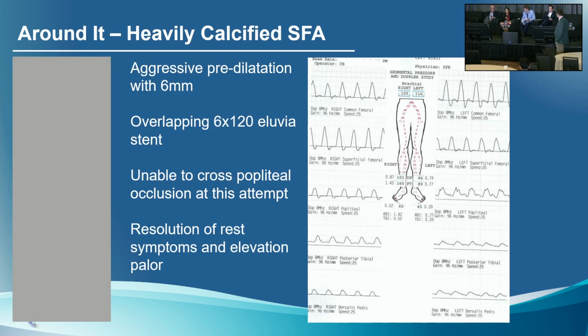Did you consider doing intravascular lithotripsy? We did. Because we're in the subintimal space, we had decent expansion, and so we felt that we were going to have an optimal result with stenting and didn't take out an intravascular lithotripsy device. So Shirling, you would do IVL in a subintimal space? I'm asking, there's nothing wrong. I'm not saying you shouldn't, but would you do it?